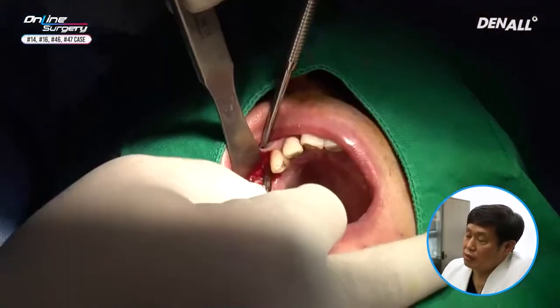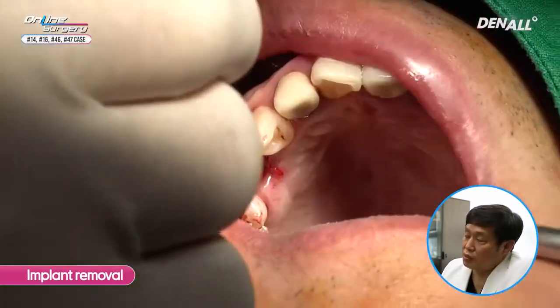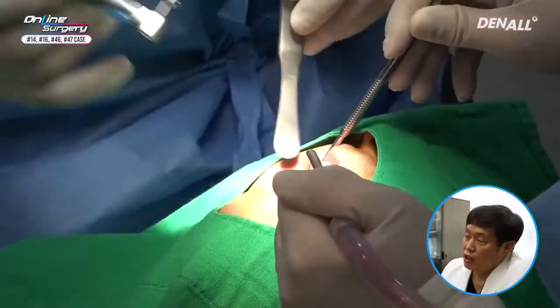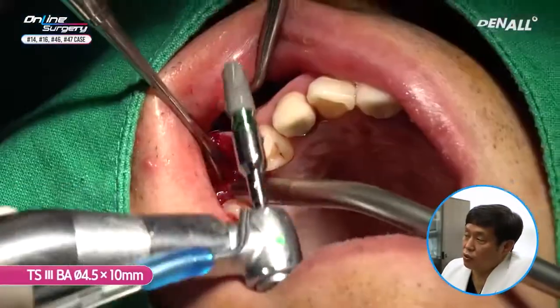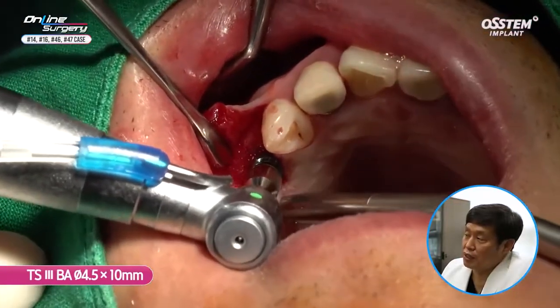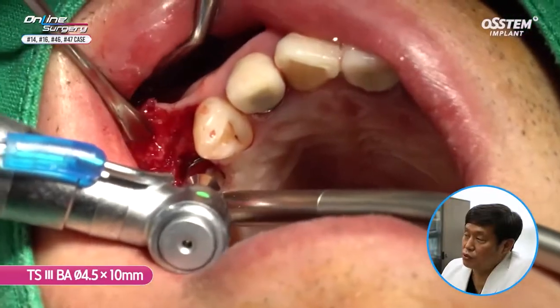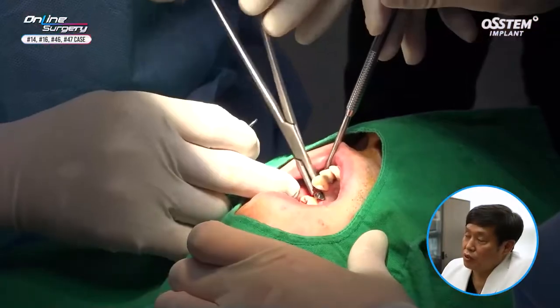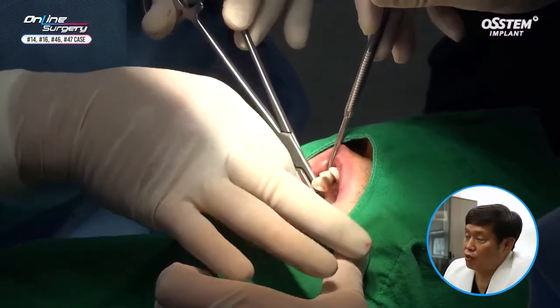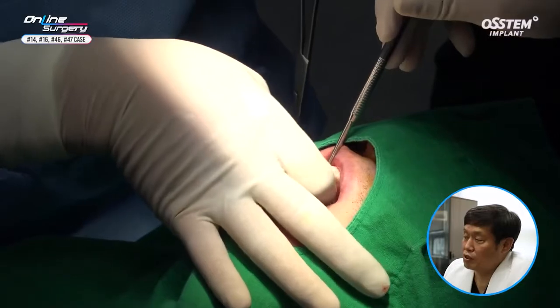The stent is removed. As for number 14, primary stability was not satisfactory, therefore implant was removed. I decided to change to diameter 4.5, but only 4.5 by 10 millimeter implant was available, so I placed it freehand. I placed the implant more palatally. Primary stability is about 10 Newton centimeter. Pre-mount is used and it is removed.